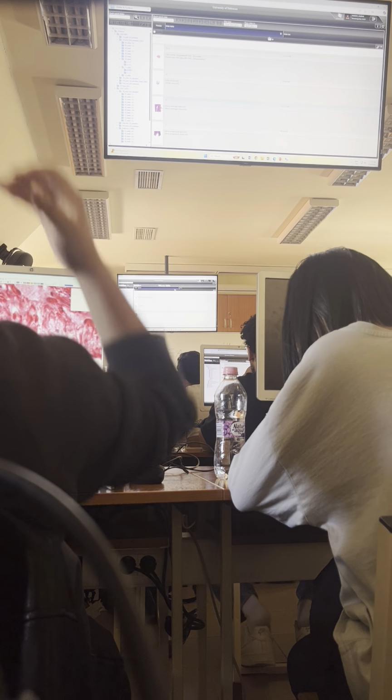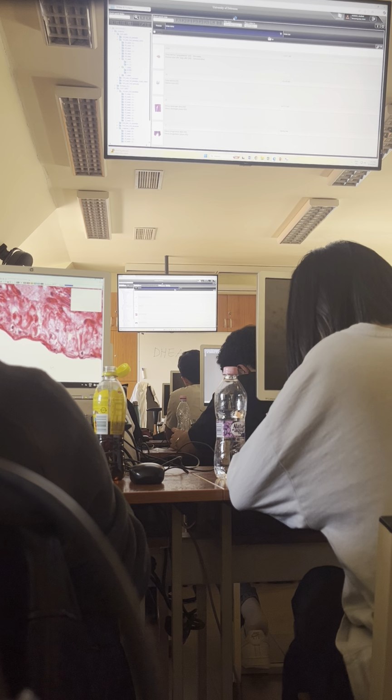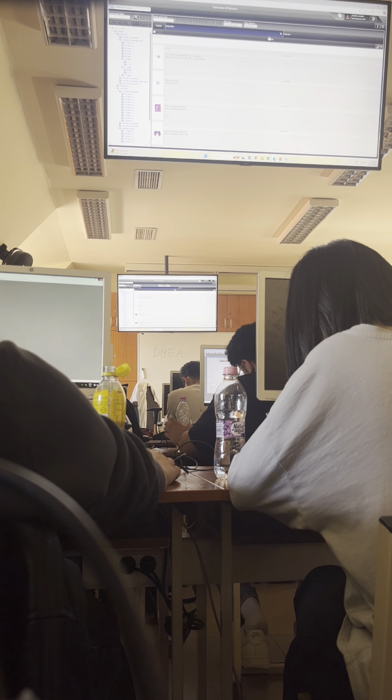There are several features on the basis of which we can decide. So I concentrate on the differences, therefore.